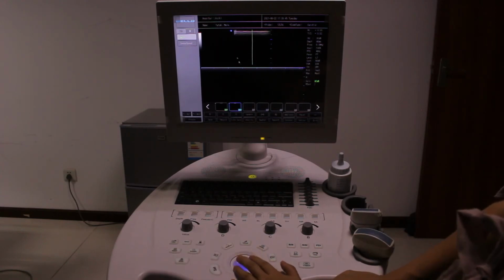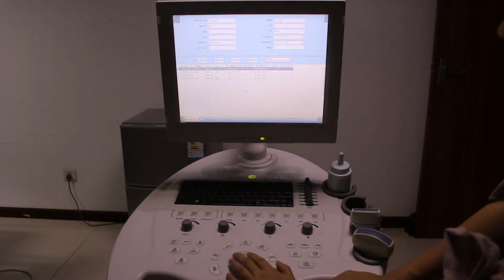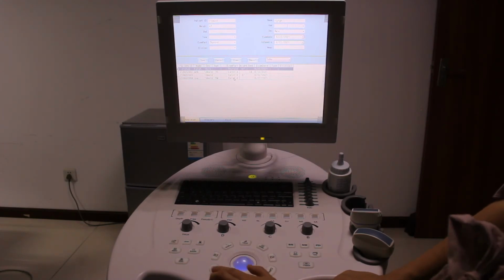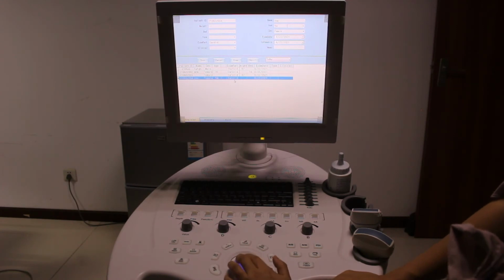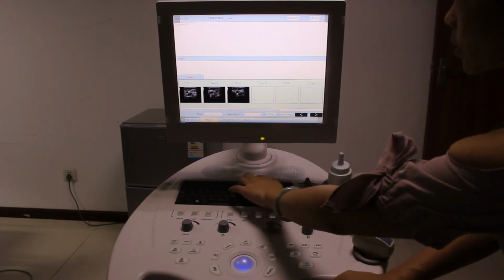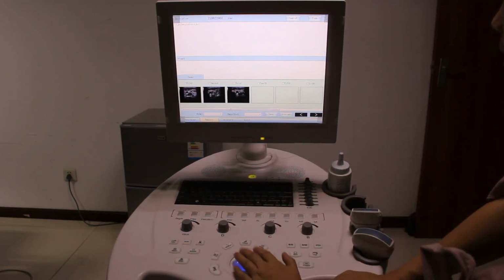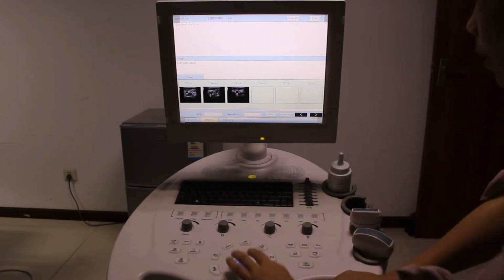So you can follow the exam or do measurement. Let's go to report. If we want to make a report, choose the patient first and press set, then press report here. Input the sentences, also the information here.